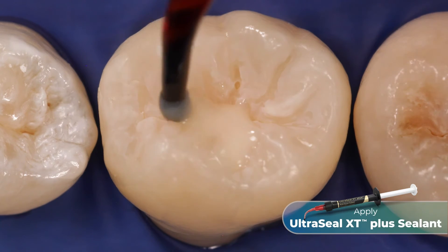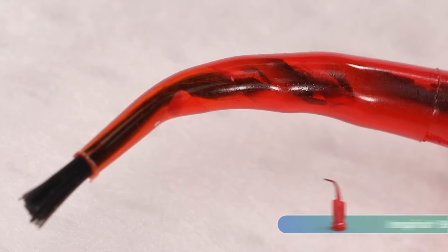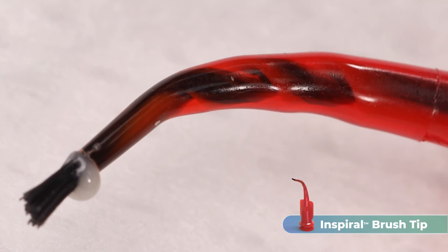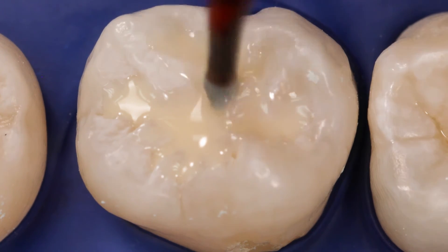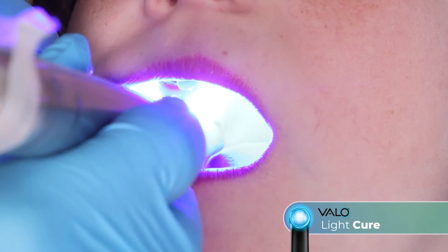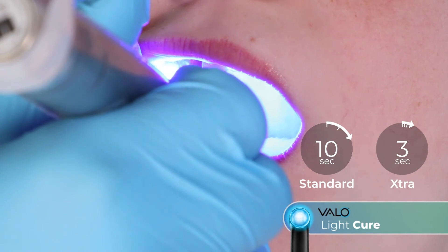Express a small drop of UltraSeal XT Plus Sealant into the grooves and work the resin down into the grooves with the brush tip. The spiral brush action of the Inspiral brush tip causes shear thinning of the thixotropic UltraSeal XT Plus Sealant. The resin stops flowing when shear thinning ceases and placement is complete, preventing it from running before it can be light cured. Next, light cure the resin using a Velo LED curing light on standard power for 10 seconds, or for 3 seconds on extra power mode.